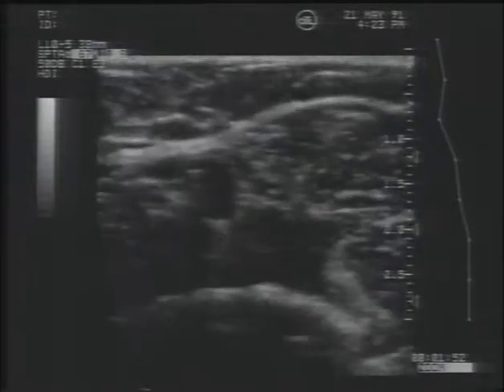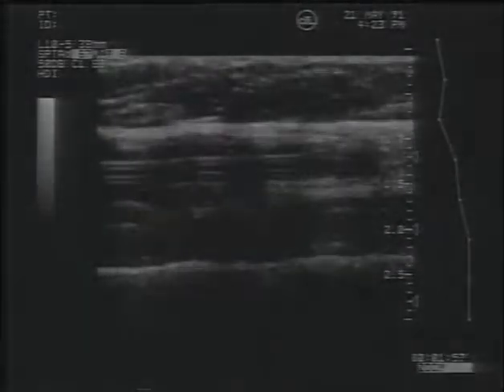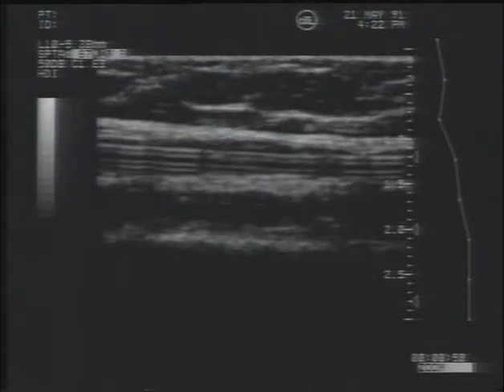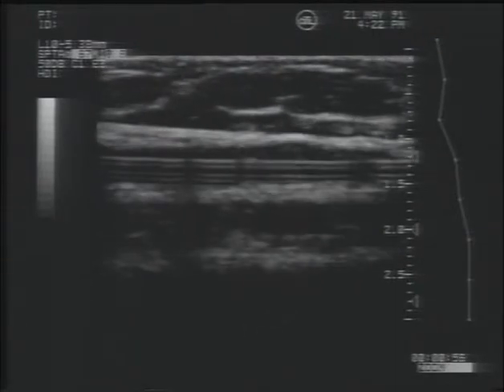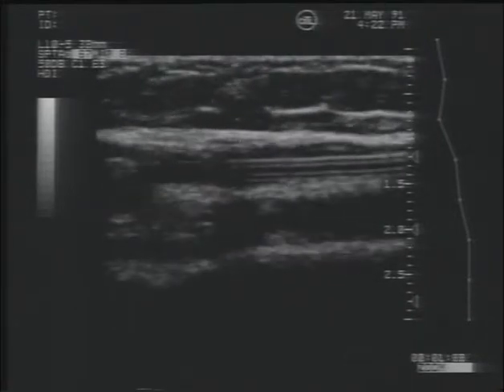Differentiation between the presence of thrombus versus catheter can be accomplished by rolling longitudinally. If the structure is a venous catheter, it will have very clean, straight, bright echoes. The line may move back and forth within the lumen when the area around the vessel being imaged is manipulated. In some cases, thrombus can be identified forming on the catheter.